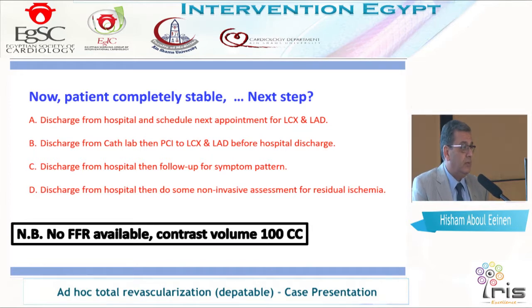So actually, due to the simplicity of the other 2 lesions, they look like 2 lesions that can go by direct stenting. We had a very short procedure. He presented early. The patient was stable. Actually, we considered the option of doing ad hoc PCI.